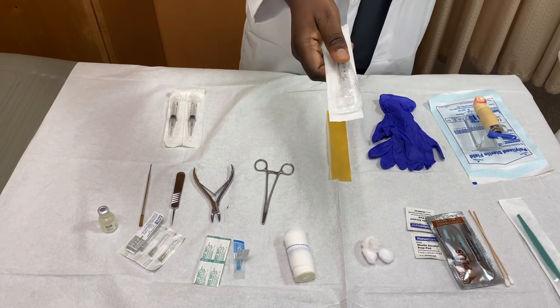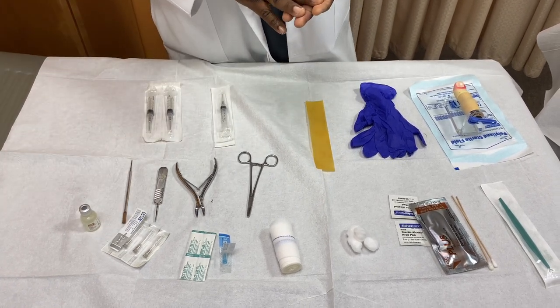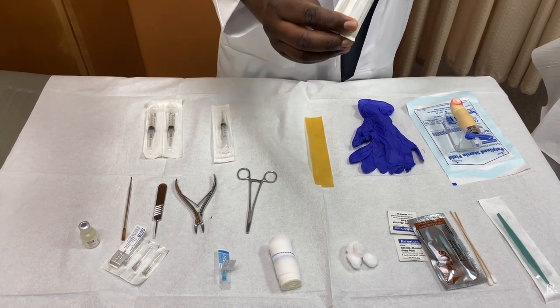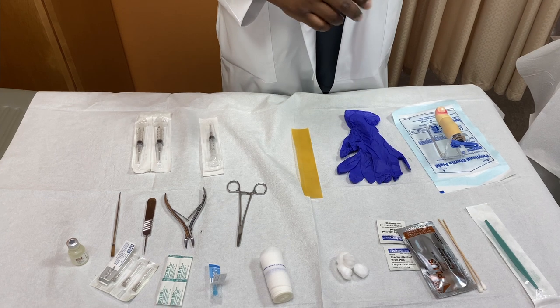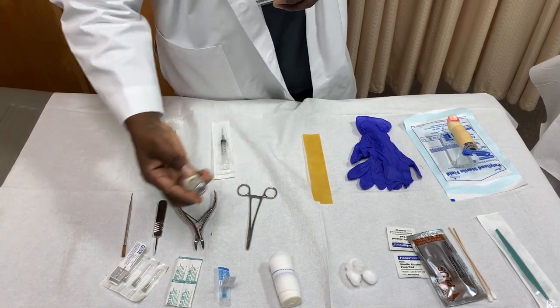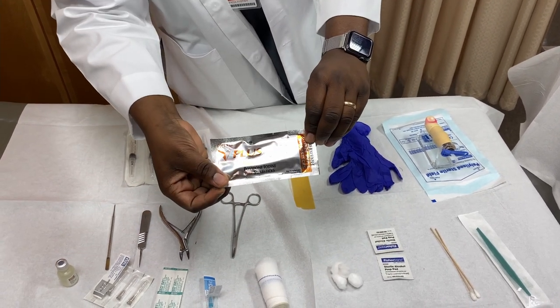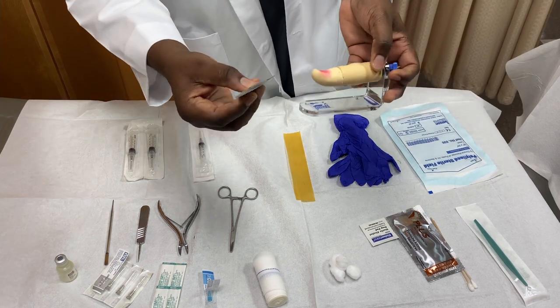Let's change gears and discuss the supplies. We'll need a 5 to 10 ml syringe. We'll need needles — one for drawing up (18 to 22 gauge) and one for administering the anesthetic (27 or 25 to 30 gauge for the actual injection). You'll also need your anesthetic, which comes in vials. For disinfection, you can use povidone-iodine or alcohol swabs to clean the digits of the toe.